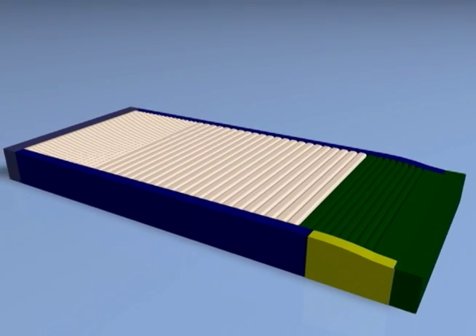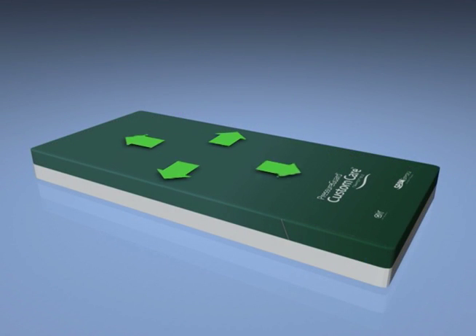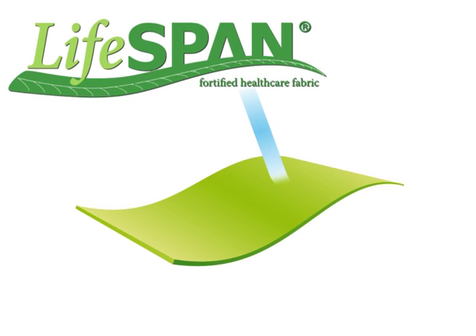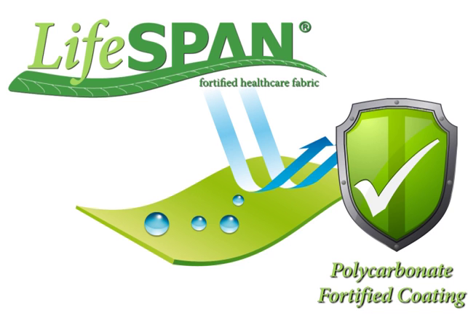Above the surface of the mattress itself is the unique design of the anti-microbial bi-directional stretch cover made with SPAN's superior Lifespan fabric. Lifespan is extremely durable and cleanable, and delivers outstanding resistance to chemical breakdown caused by bleach and other harsh disinfectants, with its polycarbonate fortified coating.